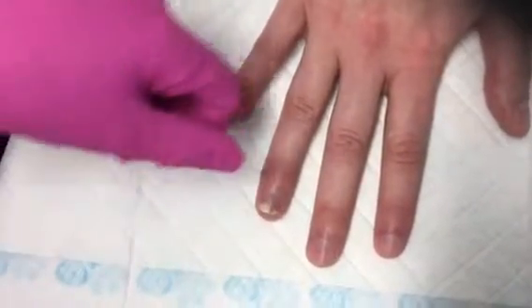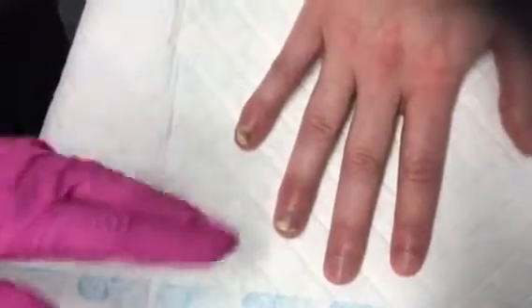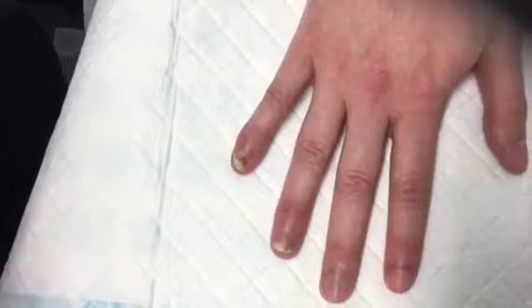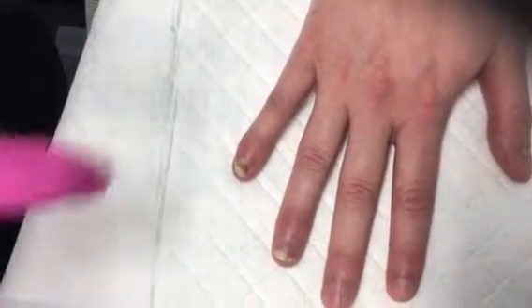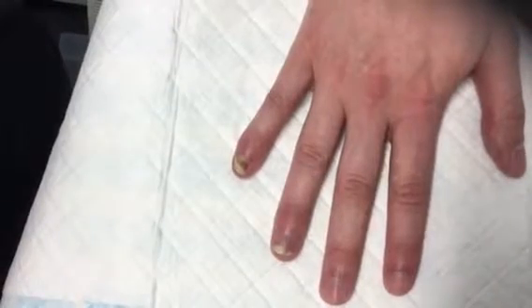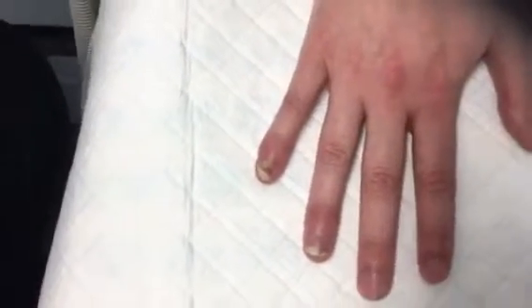This one's a lot worse than this one, but this one actually came right up to here. So you can see we've already, after just a few treatments, got some clearness there. When it's on the toes, it works the same way.